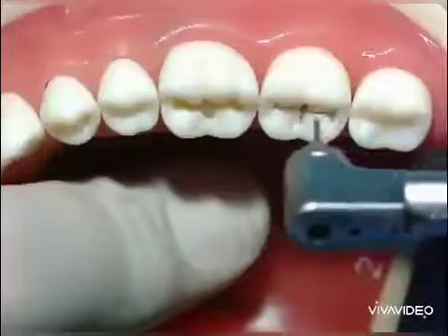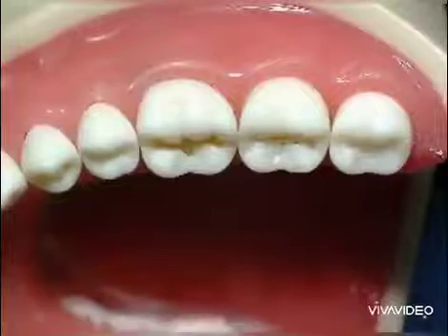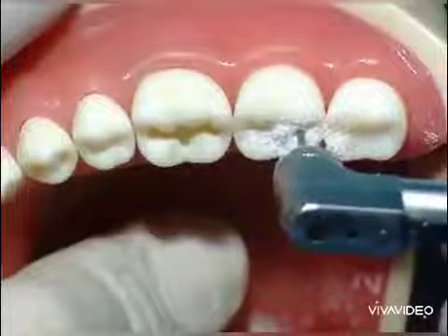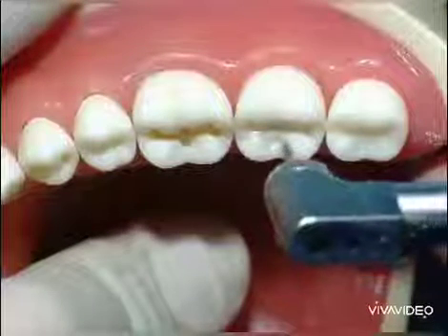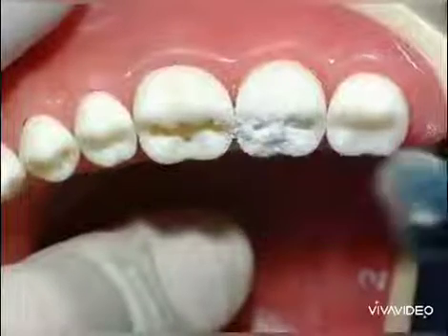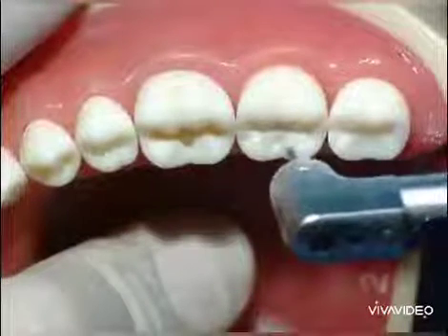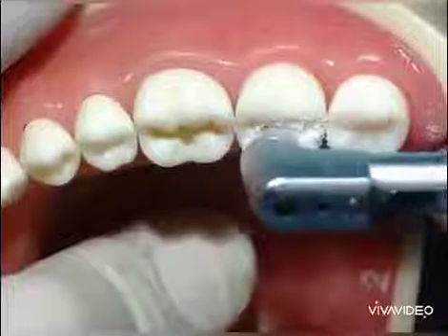This is a Class 2 cavity preparation for the lower second molar. Class 2 cavity preparation consists of two segments: preparation for the occlusal segment and preparation for the proximal segment. The preparation for the occlusal segment follows the same fundamentals as for Class 1 silver amalgam, except that the external outline is extended proximally towards the defective proximal surface. The occlusal outline form in the proximal box region is determined primarily by the buccolingual position of the contact and the extent of the carious lesion.